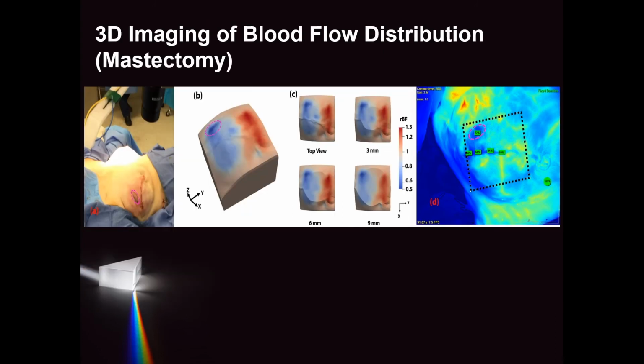And here is a picture of 3D imaging of blood flow distribution using the SC-DCT, which we put here to show you these techniques.